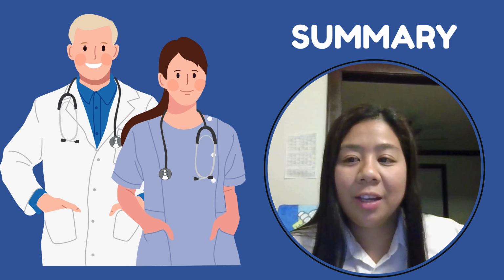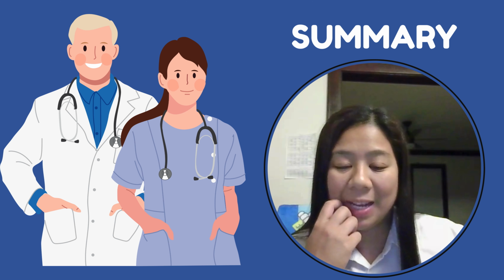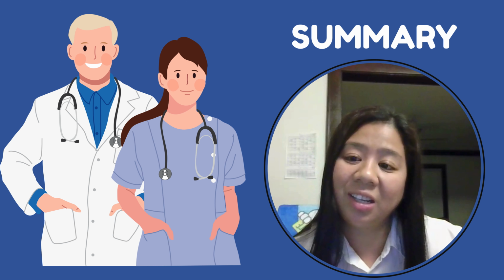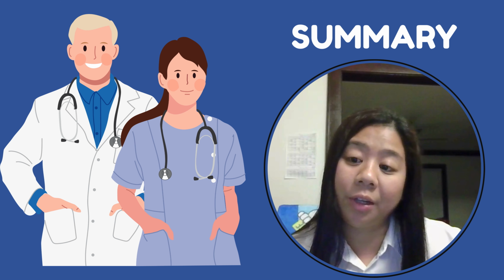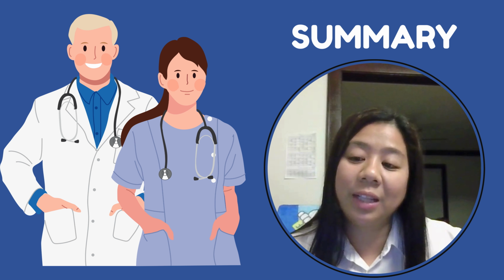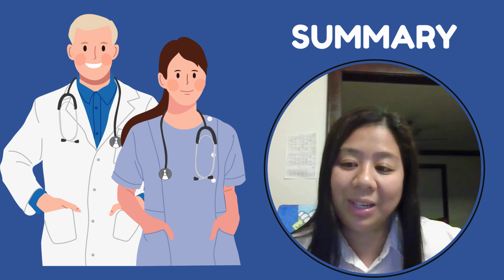In summary, the blood glucose monitoring procedure involves these key steps. First, gather all the equipment, then perform hand hygiene. Prepare the glucometer and the test strip, again, not expired. Use a sterile lancet to collect a capillary blood sample. Then apply the sample to the test strip and record the reading.